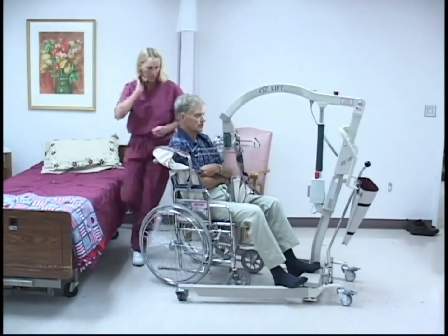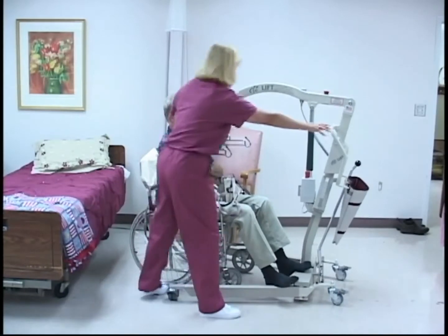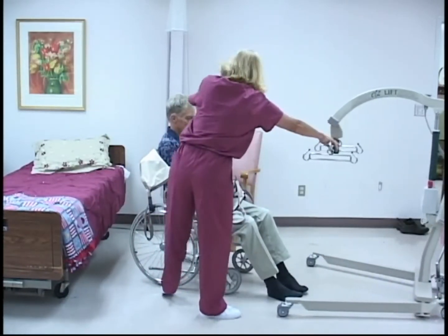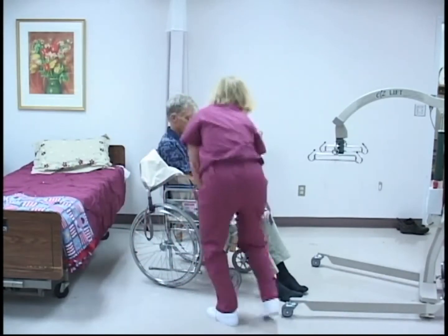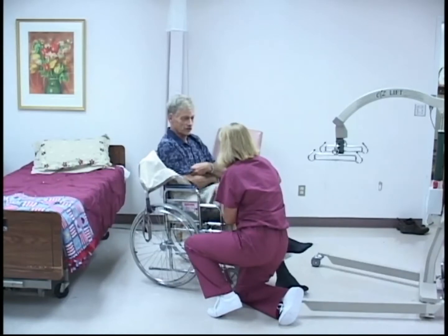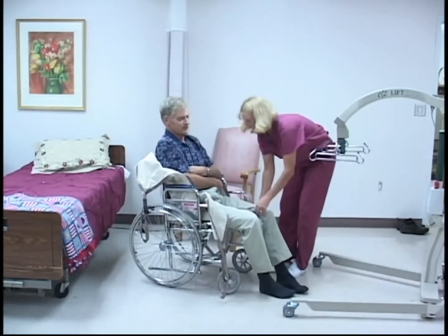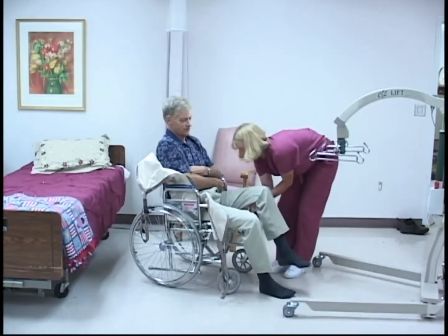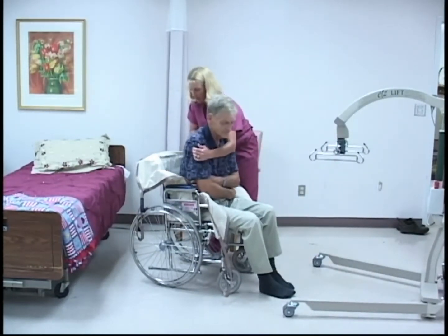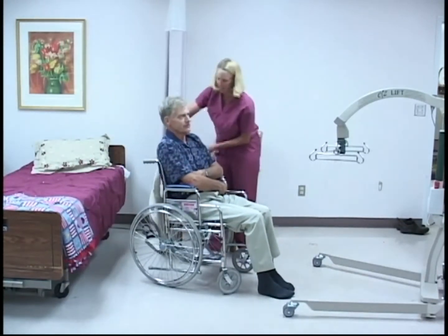Unhook the sling from the EZ lift and back the lift away from the patient. Lift the patient's knees, pulling the sling wings out from underneath the patient's thighs. Lean patient slightly forward and grasp the top of the sling and pull the sling out from behind the patient. If you choose to leave the sling in the chair with the patient, simply tuck the wings between the patient's legs and the sides of the chair.